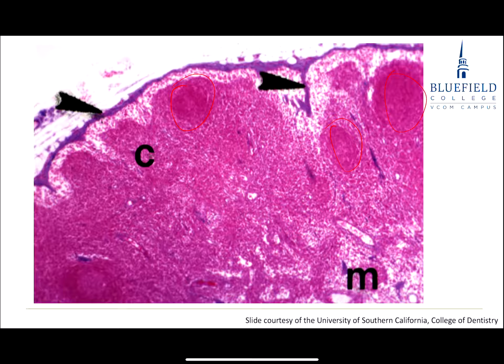I see a capsule out here, and I see a subcapsular sinus, don't I? Capsules, see, first of all, I say, this has to be a lymphoid organ. I see a capsule with a subcapsular sinus, that would say a lymph node. I have no hint of any crypts coming in. I do catch a little tiny bit of medulla down here in the corner, but not much.